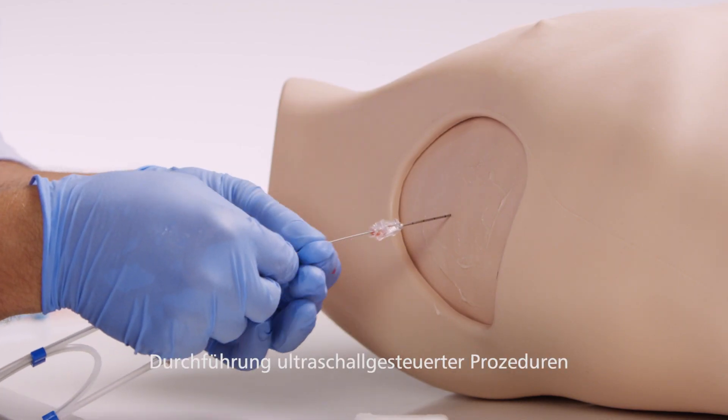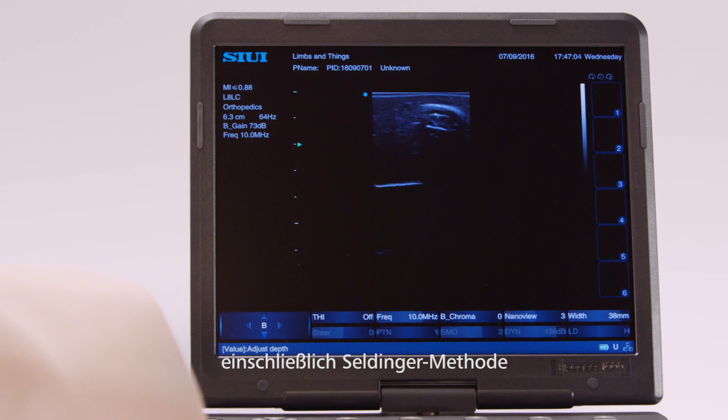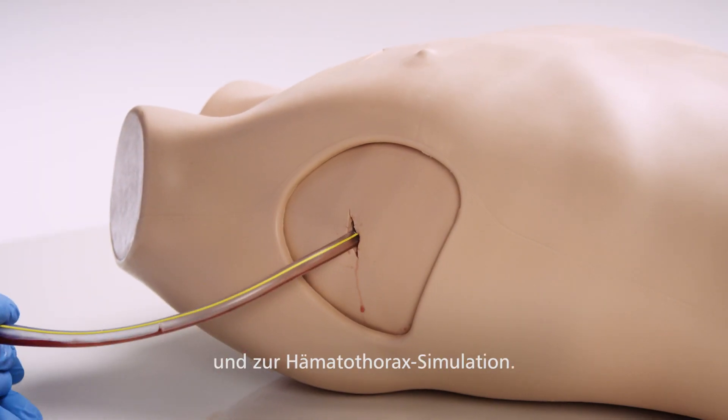The advanced pad is designed for ultrasound guided procedures, specifically the Seldinger technique, and for hemothorax simulation.